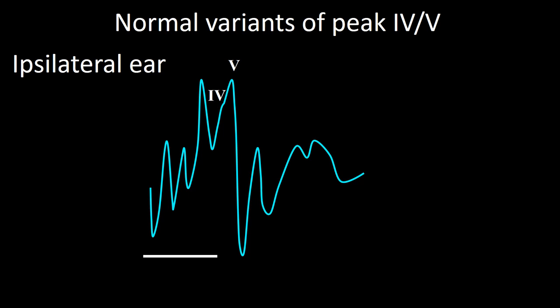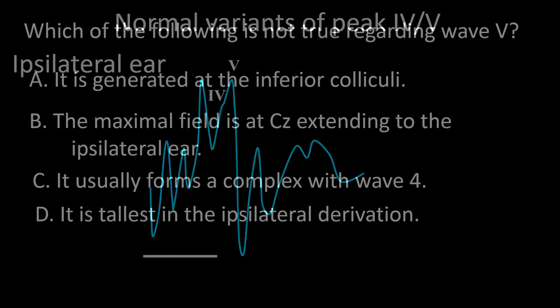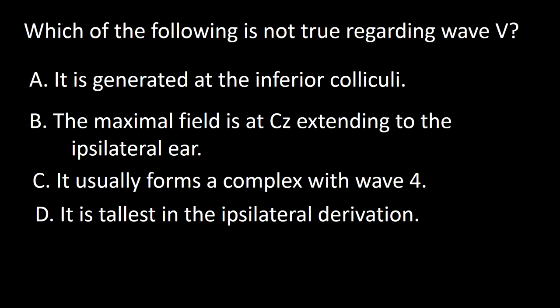One almost constant finding in relation to wave 5 is that the descending arm of wave 5 drops below the baseline of the complex. So the answer to this question is D.